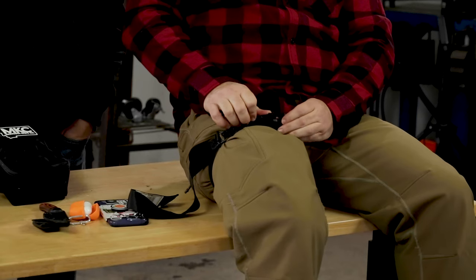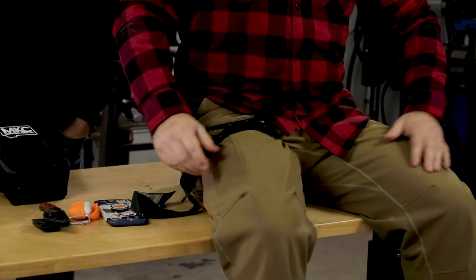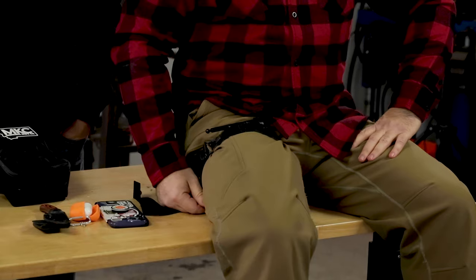With the soft-key tourniquet, we have two ways to secure this windlass. We've got the little C-grip clamp, and then we have this triangle — that's just a backup that can go over there as well. And I know that's working because that does not feel good.